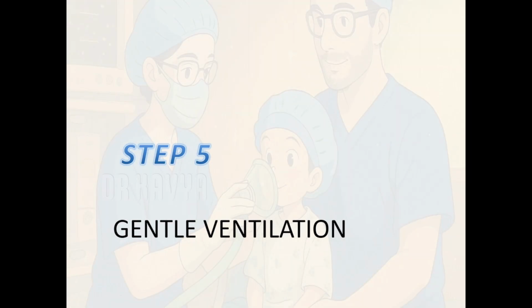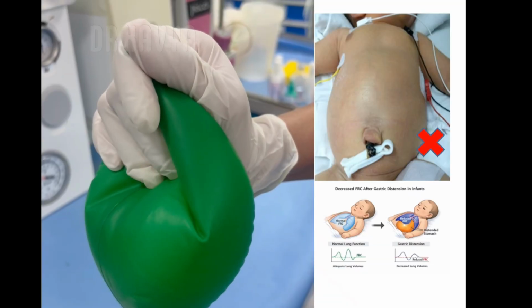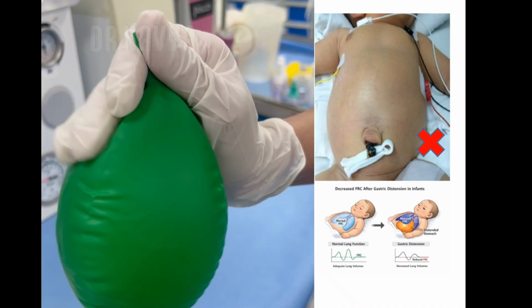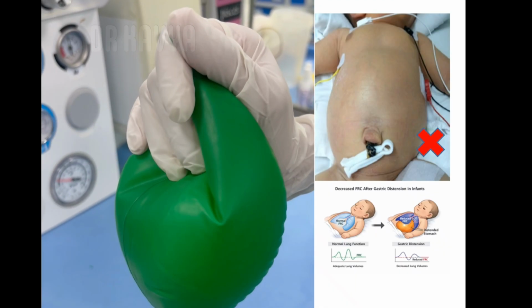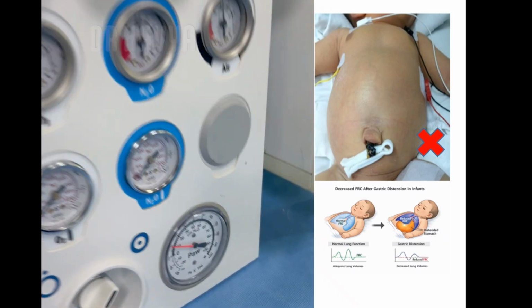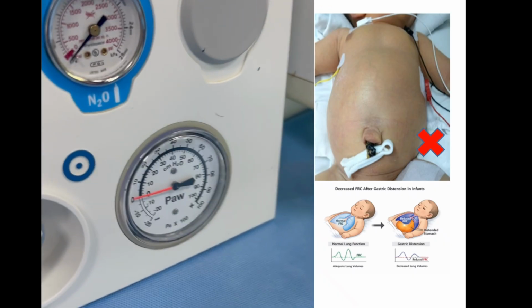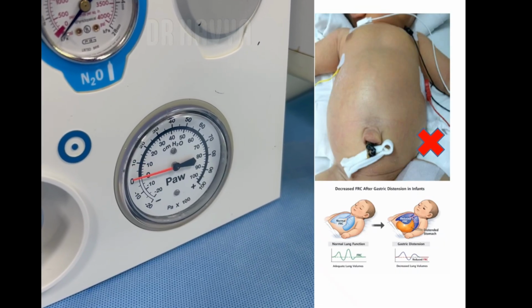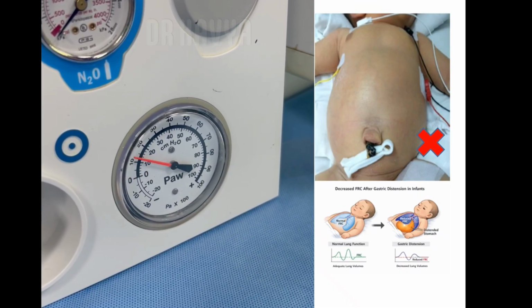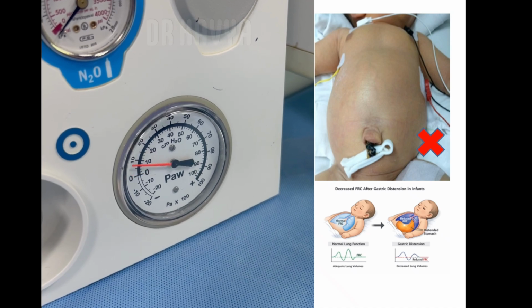Step 5. Gentle mask ventilation. Ensure that ventilation is gentle, maintaining the insufflation pressure less than 10 to 15 centimeters of water and tidal volume less than 6 ml per kg, so as to avoid gastric distension, which decreases FRC in children and worsens ventilation.